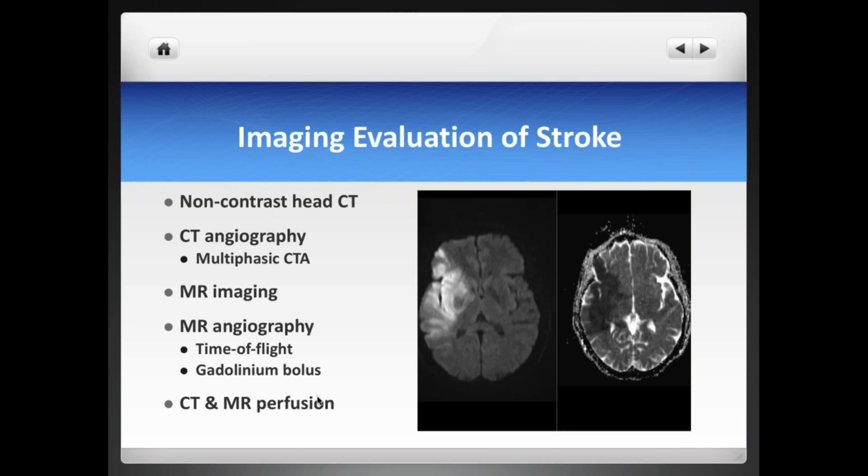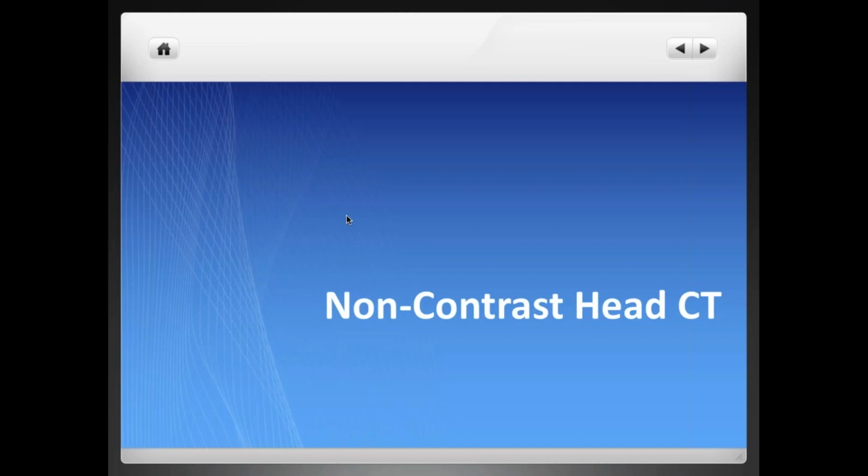So now let's switch gears. I wanted to give those slides as an introduction and make everyone understand why we focus on stroke nowadays, and that we're really living in an exciting time for stroke. I think there hasn't probably been any other time as exciting as this one in the stroke field. Let's talk now about imaging evaluation of stroke and how we triage patients with stroke. I'm going to start with the simpler things, like the non-contrast head CT, and go through all the imaging modalities that we use nowadays for stroke.